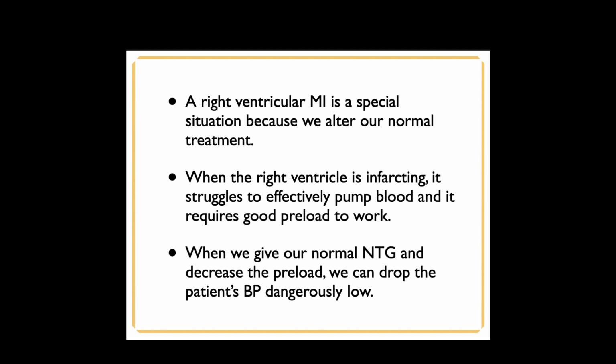But in this class, when I ask you the question, should you check for a right-sided MI, I am assuming you're working under a protocol where you do check for a right-sided MI, meaning you move V4 over, okay? So, what's the answer to the question? When do you check for a right-sided MI? What do you see on the 12 lead?